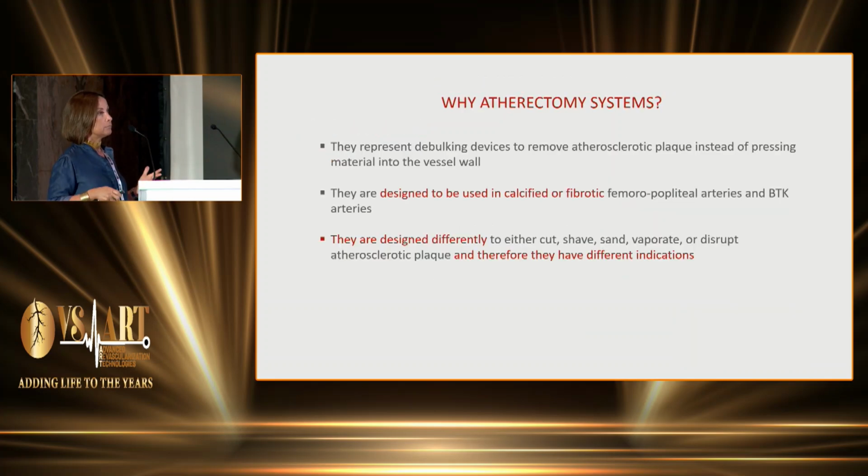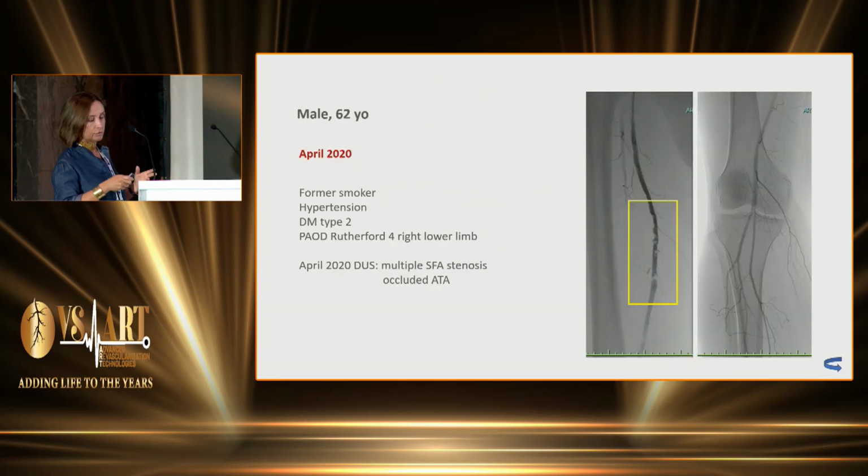Why then atherectomy systems? In general, what they actually do is remove the plaque, so they can work in an eccentric way according to the way they have been built, and so they remove the plaque.